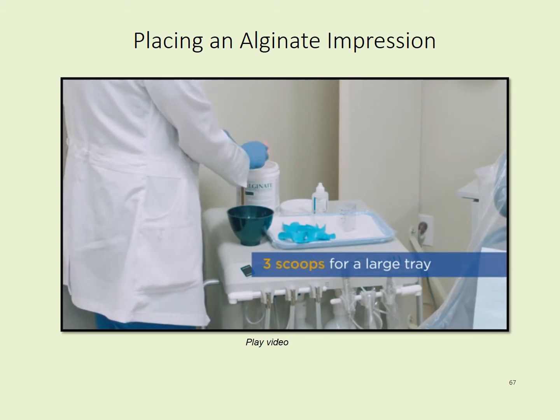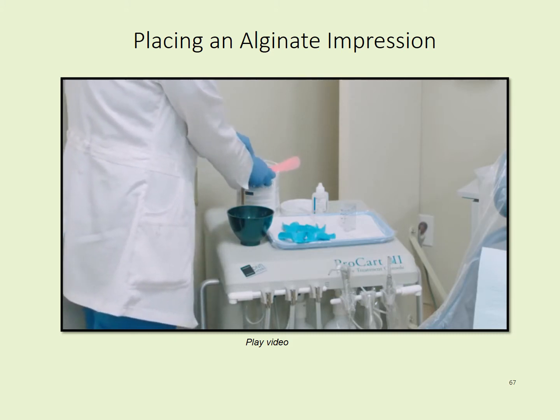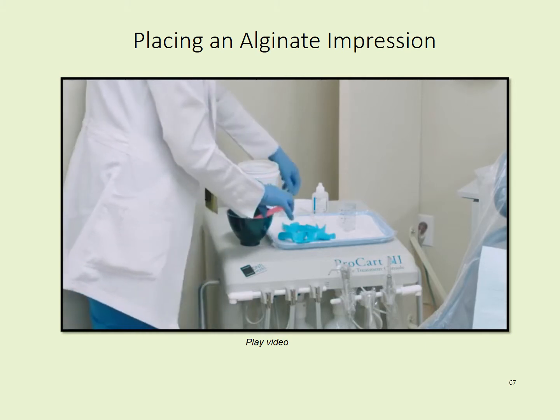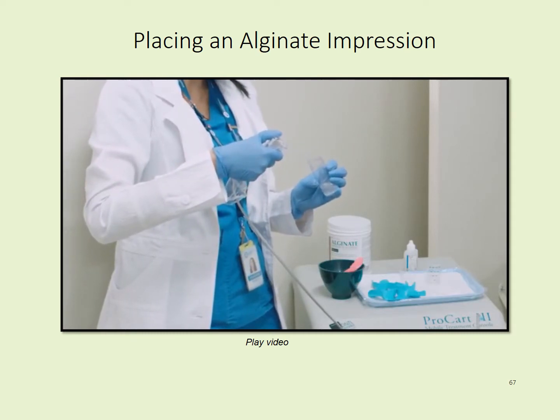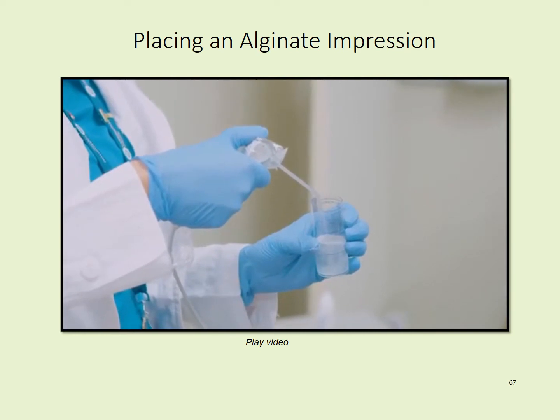Because I'm using a large tray on our patient. Again, measure the scoops, pat them down, compress them with the spatula, even them out, and then place them in the bowl. Every operatory has water, so you should be able to fill up your measuring cup with water. We use 3 scoops, so I want to go ahead and use 3 scoops of water.